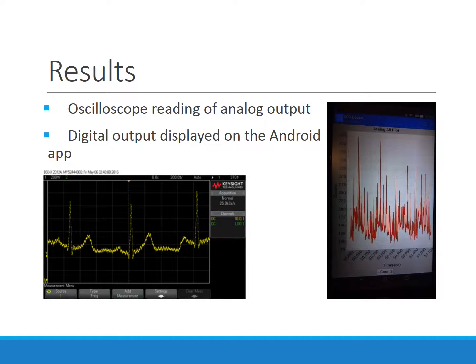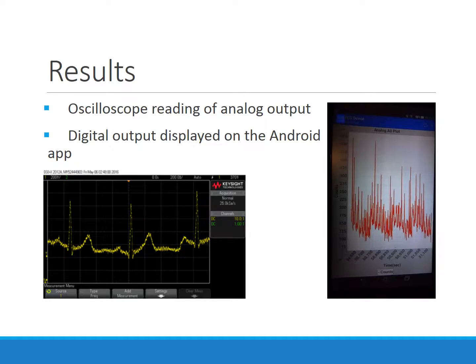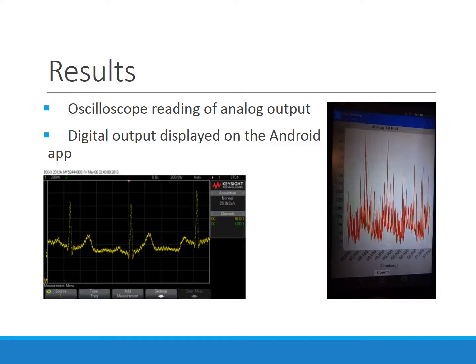After some research, I found that the delay of the Bluetooth caused almost a similar effect to a low-pass filter. This was able to eliminate some of the noise and provide the results that I wanted. The video on the right shows the working result that I have.